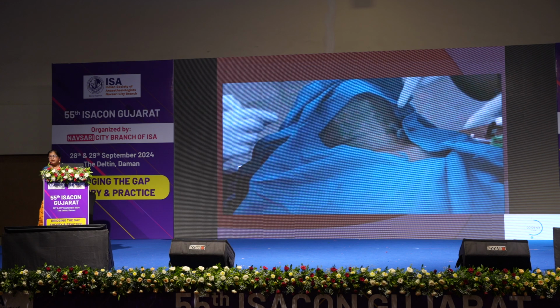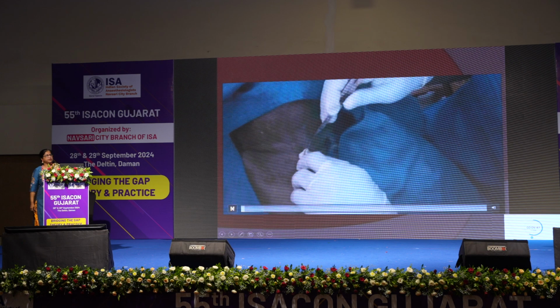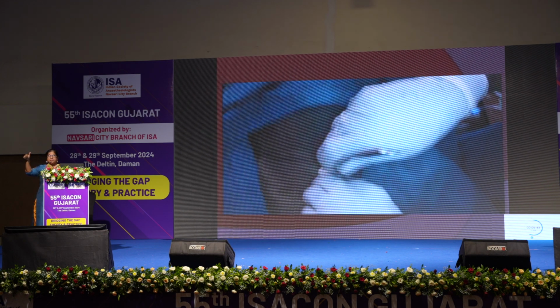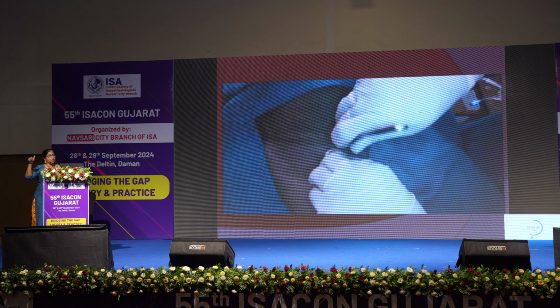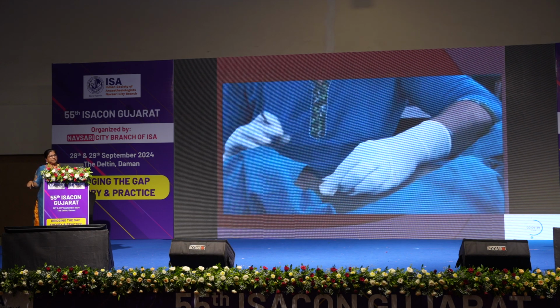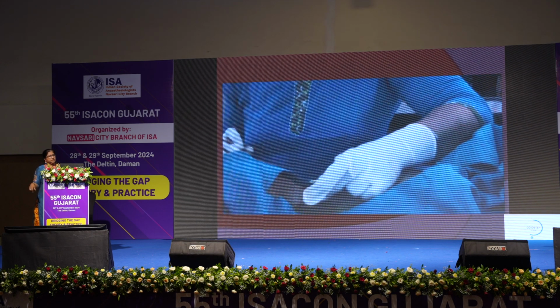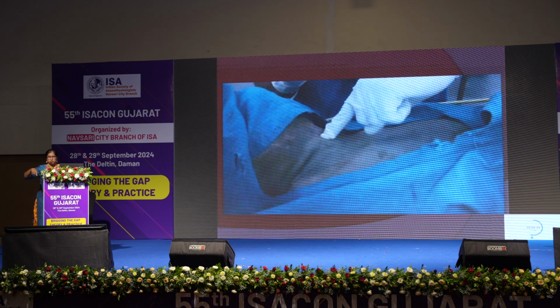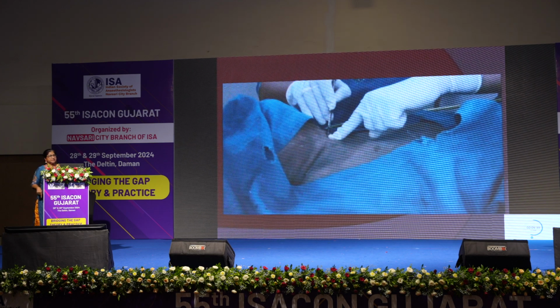So next is in the cadaver, which also you can see, because that was a good cadaver. This is in the actual cadaver, taking a stab incision. Identifying the cricothyroid membrane is very important. Palpate for the cricothyroid membrane. Point it out. Make a vertical stab incision.